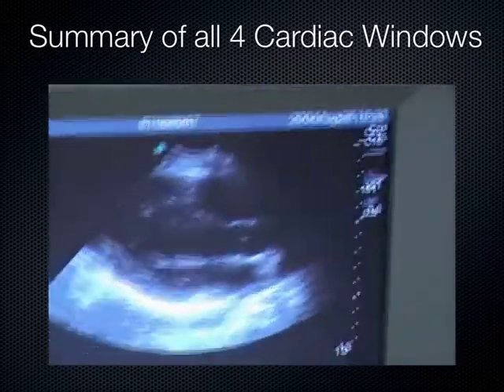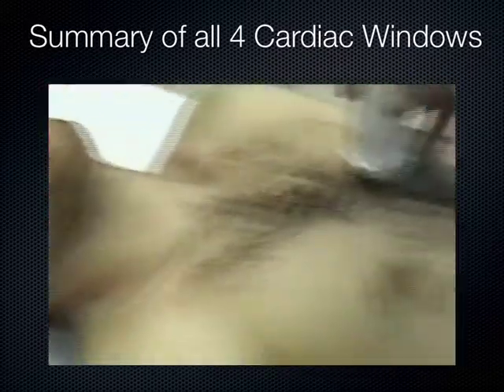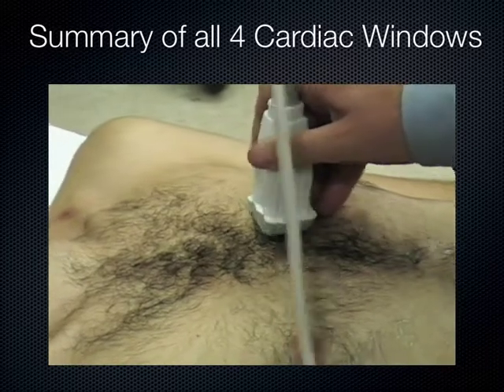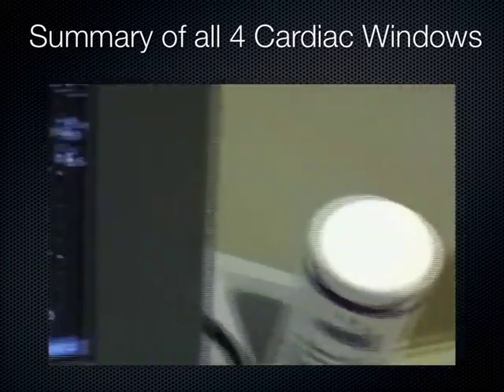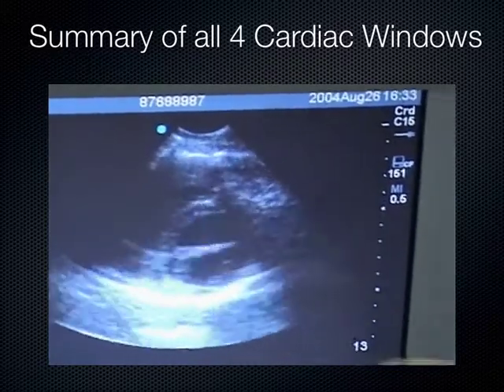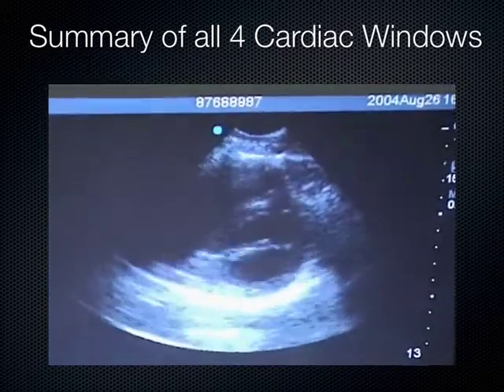If I want to do a parasternal short view, I simply take my probe and then I rotate it 90 degrees, and now you look on the screen and we'll see a parasternal short view. Sometimes we call this the fish mouth view right here because it looks like a fish mouth.